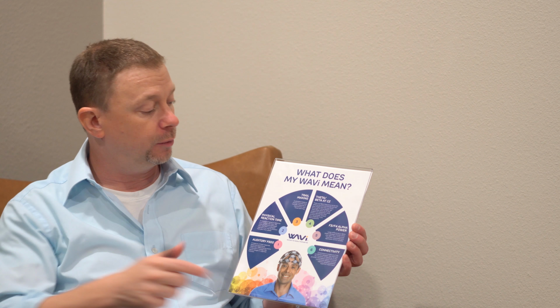So we want balance here. We don't want exact numbers. We want a range of numbers that are statistically normal. But F3, F4 has to do with how balanced is the right versus the left frontal lobes in their alpha waves.